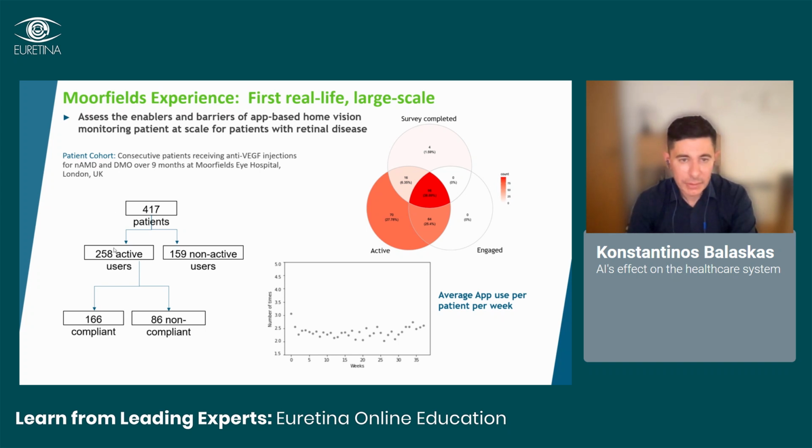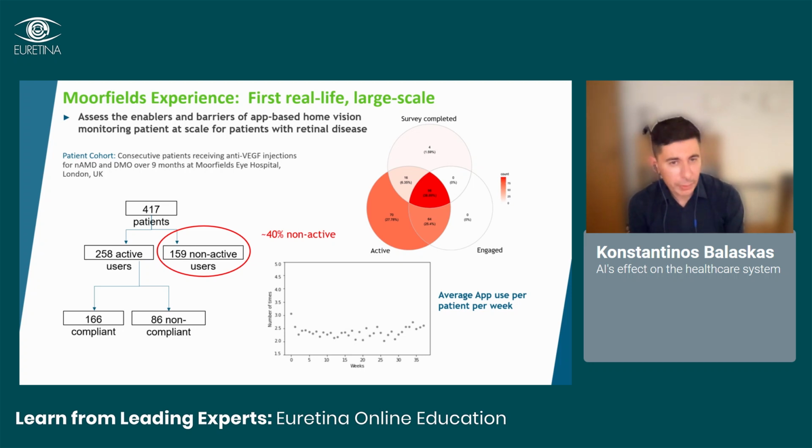You can see here that, very reassuringly and encouragingly, more than 60% of our patients, who are elderly patients with neovascular AMD, were able to make use of this technology. Around 40% were not able to use it. And of those who were able to use it, not everyone used it in a compliant way.